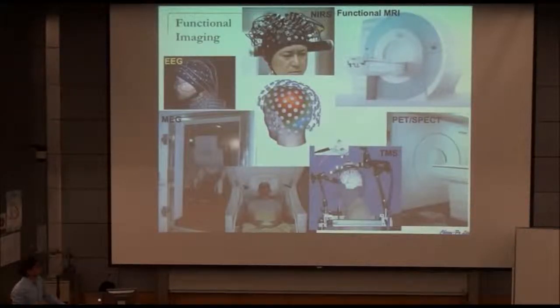So with these techniques, it can actually interrupt local neural activity, so we can also know what the brain functions are in this region. So here is a very powerful method for electrical measurement.